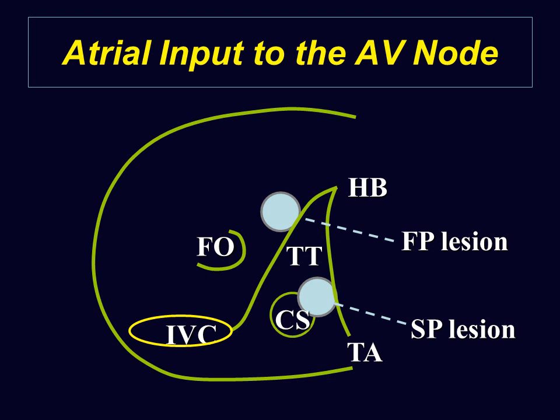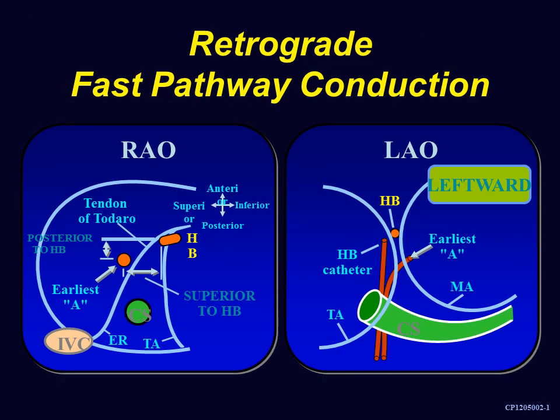Generally, it is better to start with a larger ventricular electrogram, as the AV node is more of an atrial structure. I think it is better to go around this location. Only if it continues to be inducible and becomes a problem, then you can go a little higher up. Now, within the CS, the initial 2.5 centimeters may host the compact AV node. It is better to avoid this location.